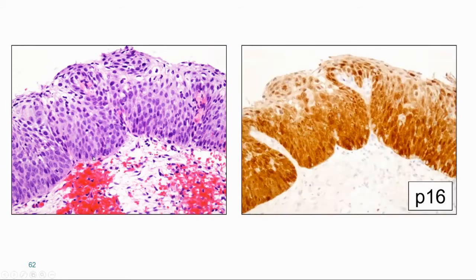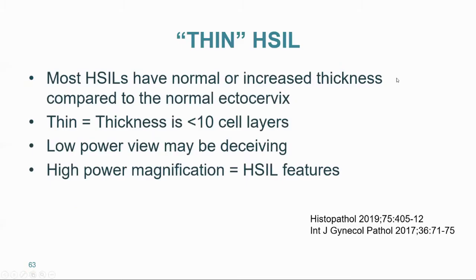This is a lesion with a metaplastic look. It makes you think of immature squamous metaplasia, but hopefully you can appreciate the loss of organization, overlapping, and nuclear enlargement that correlate with P16 overexpression and a high-grade phenotype.